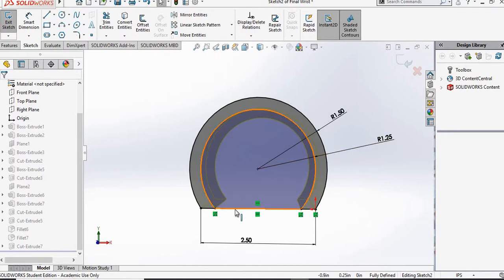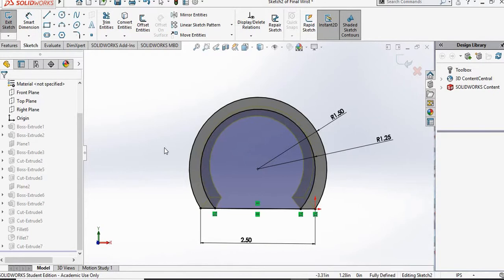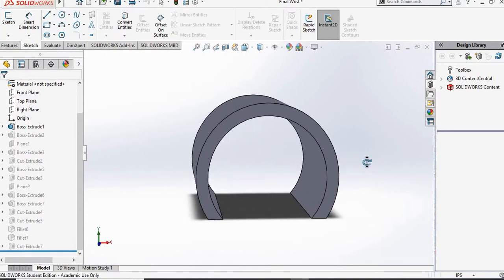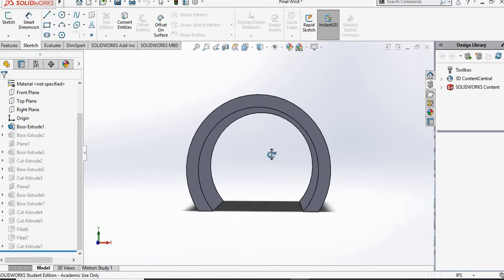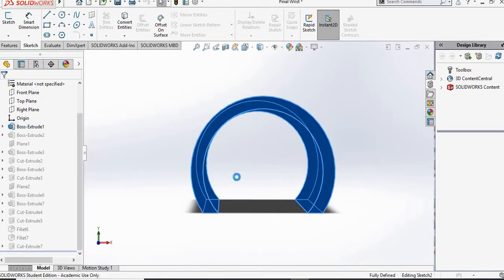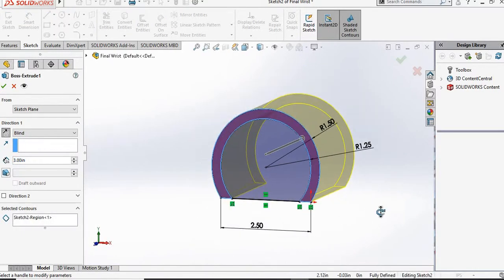You want to create two arcs, again, two arcs, and what this does is, instead of having to go in and doing the cut extrusion after doing the first extrusion, by doing two arcs together, you can right away cut it, as you can see here. So I didn't need to create a second sketch to make the cut in this middle portion. And we extruded it for 3 inches.